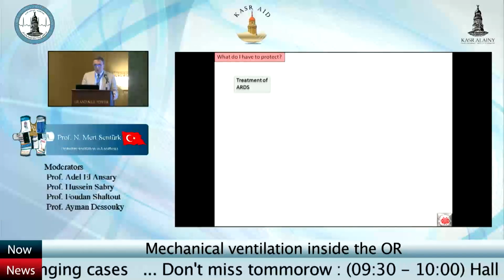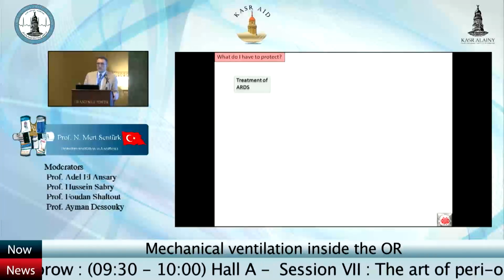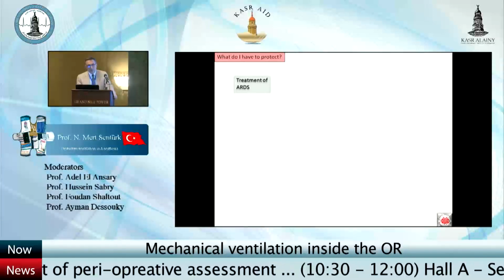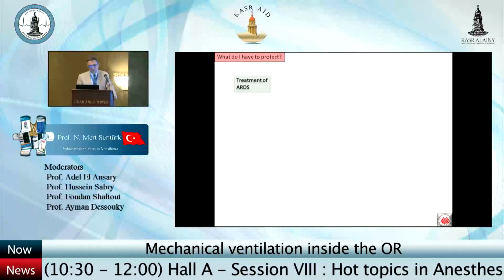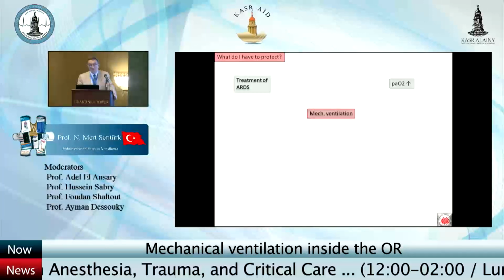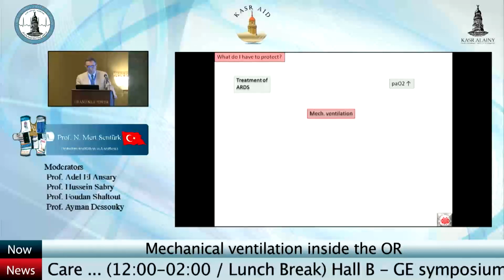So, what do I have to protect? We have the experience also as anesthesiologists, the experience from the treatment of ARDS in the ICU. When we started mechanical ventilation in the treatment of ARDS, the only target was to improve the oxygenation of the patient, and therefore the mechanical ventilation has been invented.